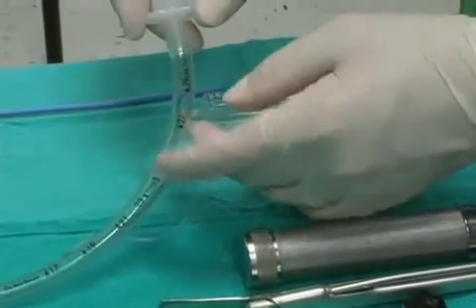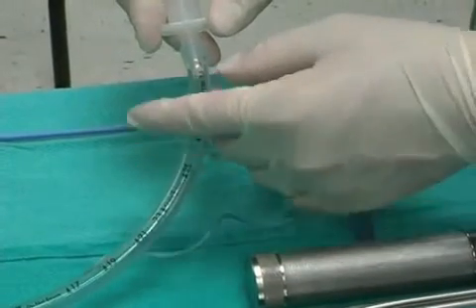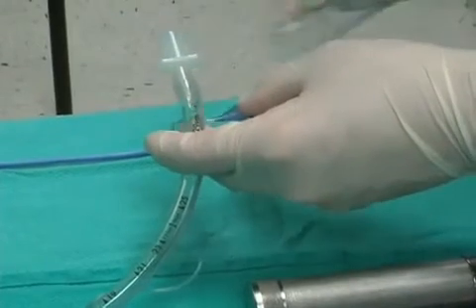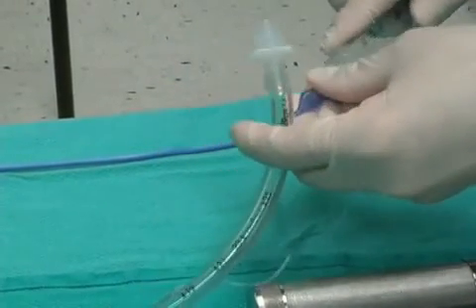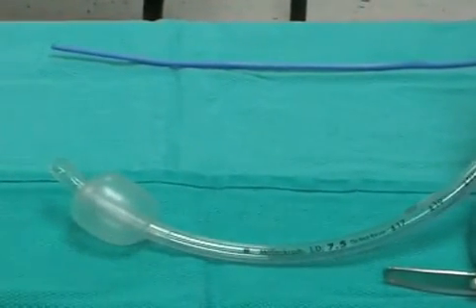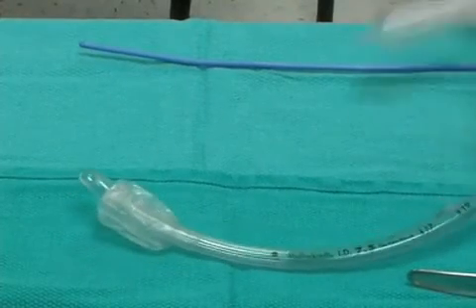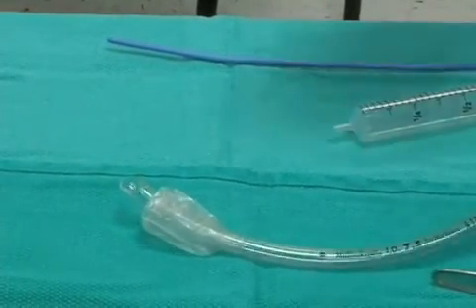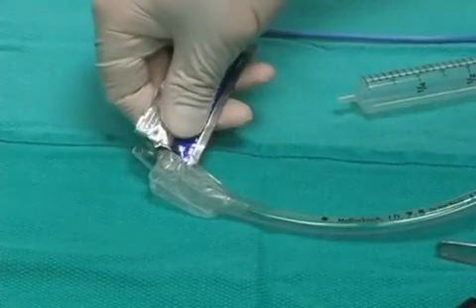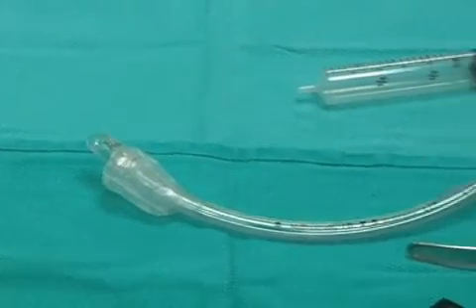In women, typically a 7.5 to an 8.0 tube is chosen. In men, an 8.0 to 8.5 tube. The balloon cuff on the tube must be tested. The end of the tube may be lubricated with a water-soluble lubricant. The use of a flexible stylet is recommended.